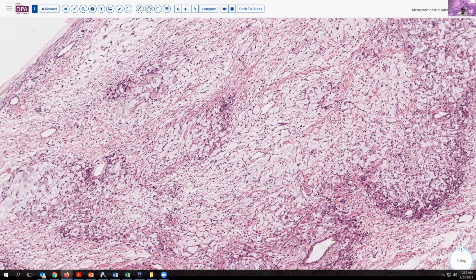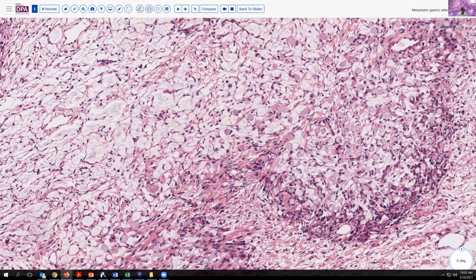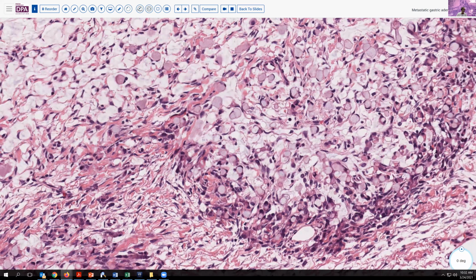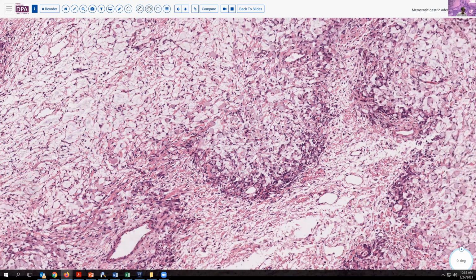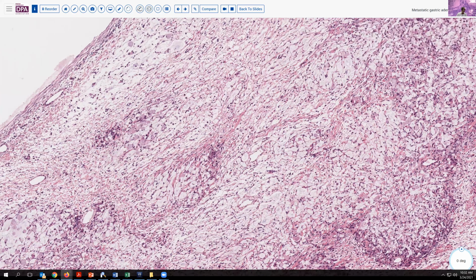But it's associated with, as we see here, these very dilated signet ring cells that are characterized as a carcinoma. And they're sort of condensing at the periphery of these nests, but with this filamentous or filigree pattern, essentially pseudomyxoma ovarii involving and dissecting between the stroma of the ovary.